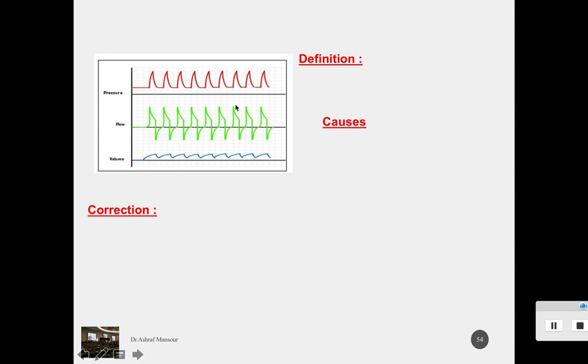So the baby is given no support, with loss of tidal volume. At that time you can find that the baby who was given 20/5, now the PIP is 8 or 7, the same as your CPAP. The baby is so tachypneic, there is deterioration in the blood gas, and sometimes the PCO2 is washed out.